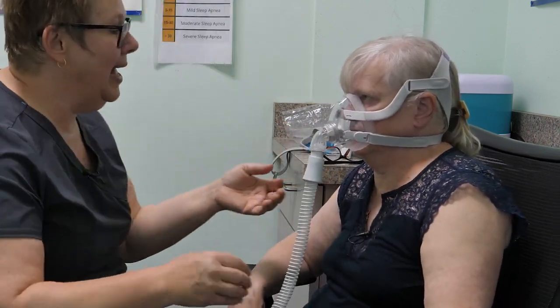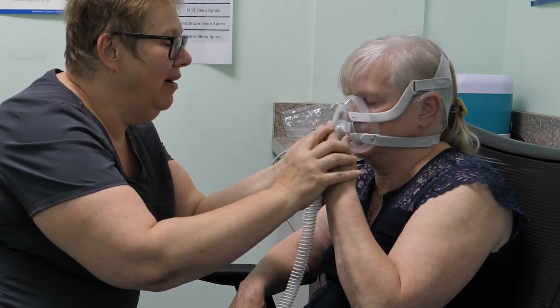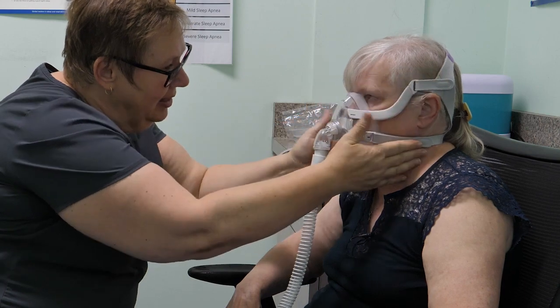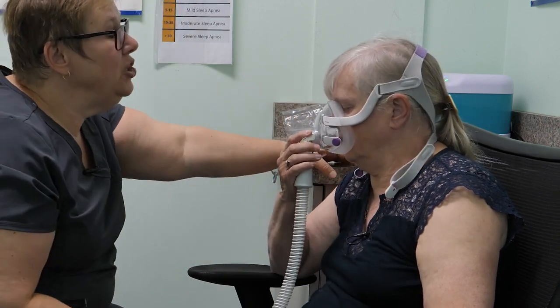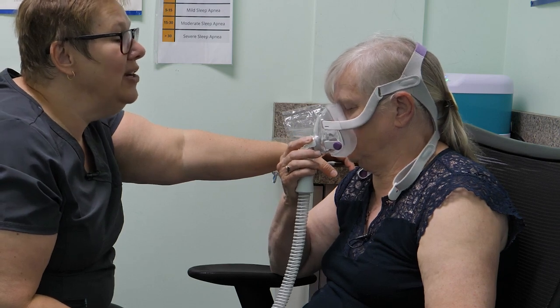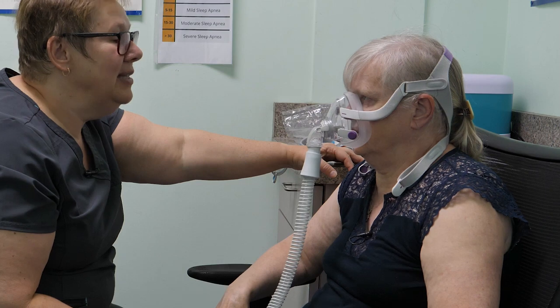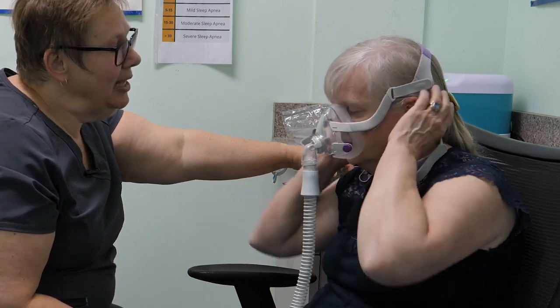That's good, I'm glad. So the same thing up here, you do have the exhalation valve there. So if it leaks up here, you would be tightening these ones and these ones. But before we go too far, I want you to actually do that 1, 2, 3 thing now. Just very, very gently. It doesn't have to be very much. Okay, and now seal it on your face. And then I want you to take your magnets and put them in place.